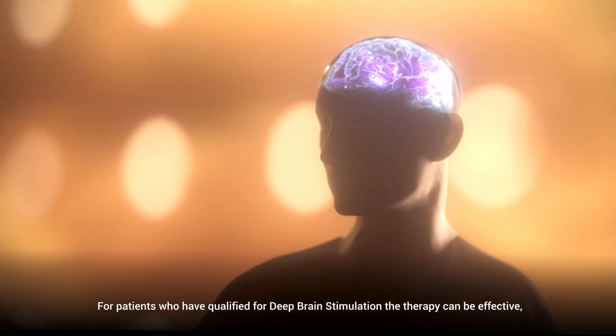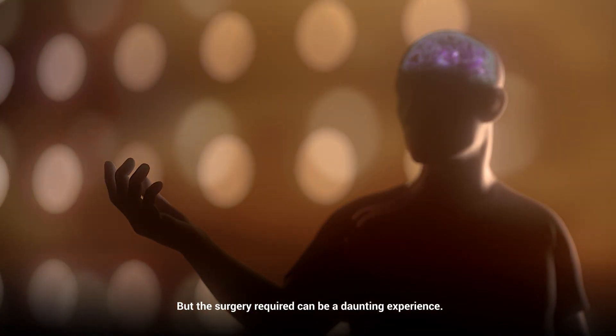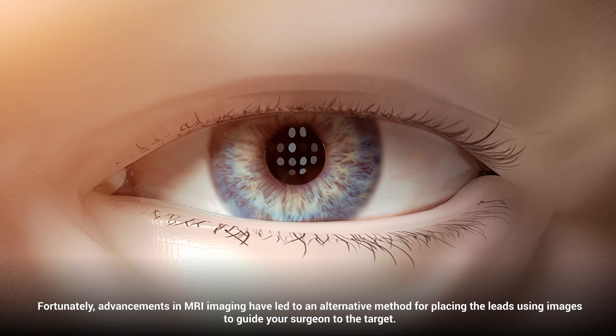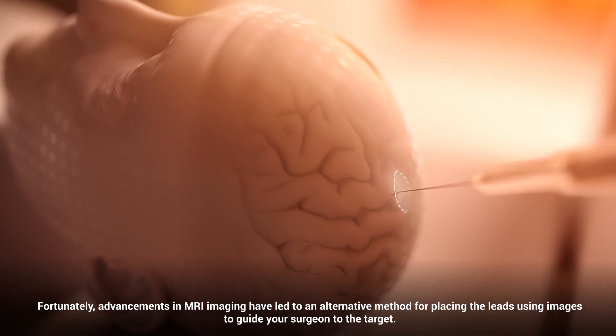For patients who have qualified for deep brain stimulation, the therapy can be effective but the surgery required can be a daunting experience. Fortunately, advancements in MRI imaging have led to an alternative method for placing the leads, using images to guide your surgeon to the target.